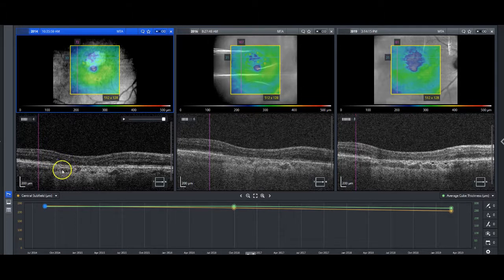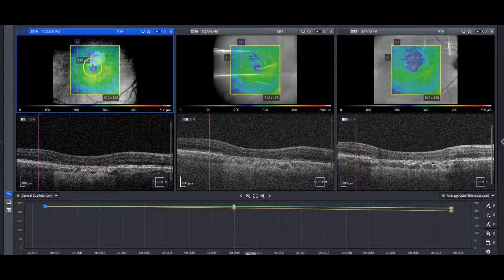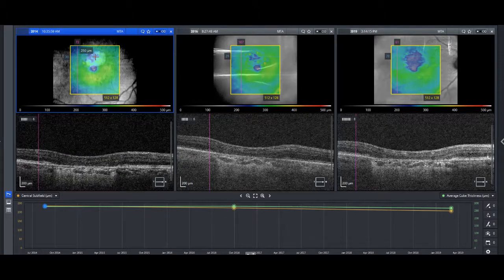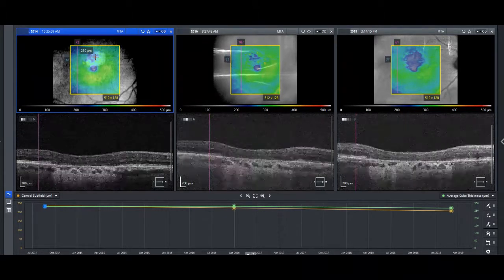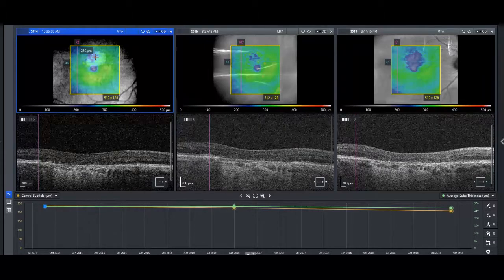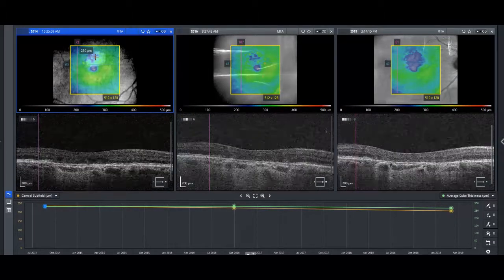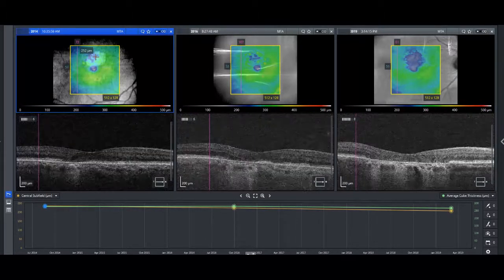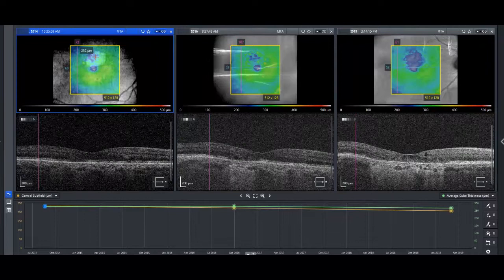Very common in substantive areas of geographic atrophy: ellipsoid zone loss, RPE loss, and this hyper-reflective transmission area below. So again, this is geographic atrophy, and if we just scroll around a bit heading back towards the fovea — there you go. Now you can see the ellipsoid zone is reconstituted.